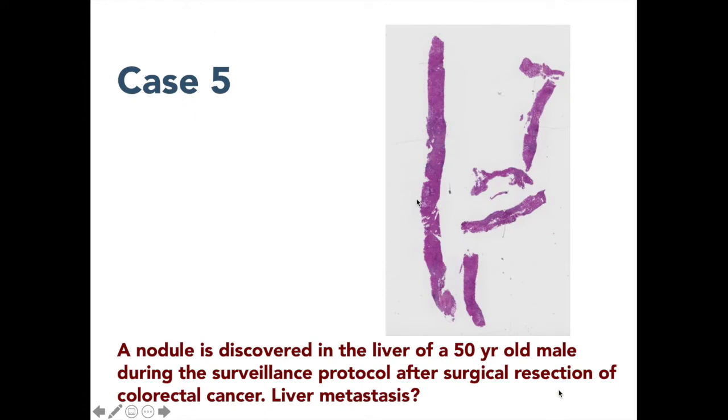So this case was a biopsy of a nodule that was discovered in a patient undergoing surveillance after a surgical resection of a colorectal cancer. And the question was, is it a liver metastasis? So let's look at the slide.